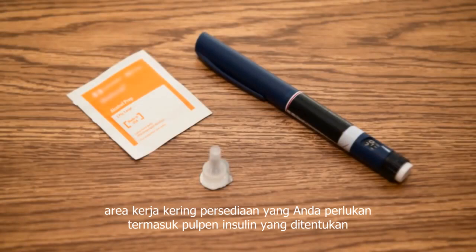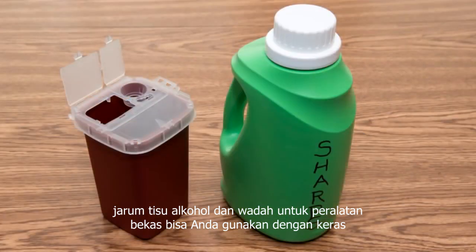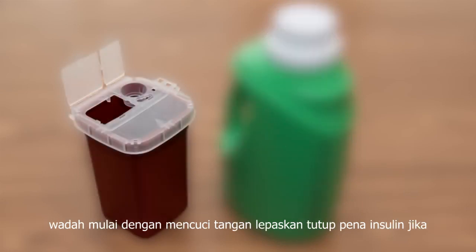You will need the prescribed insulin pen needles, alcohol wipes, and a container for used equipment. You can use a hard plastic container with a screw-on or tight lid, or a commercial sharps container.